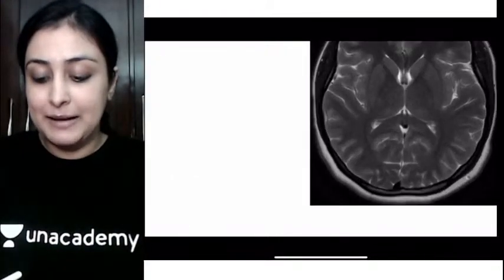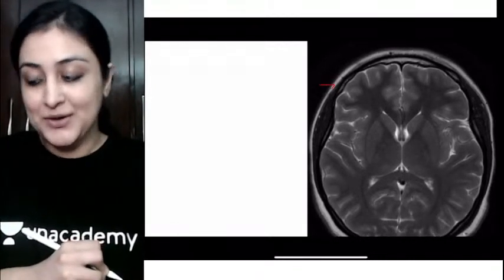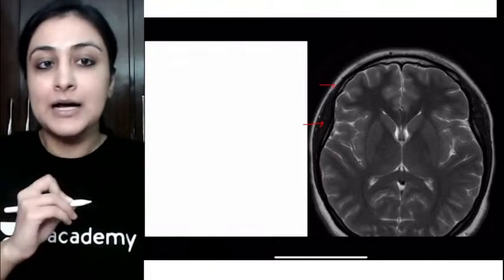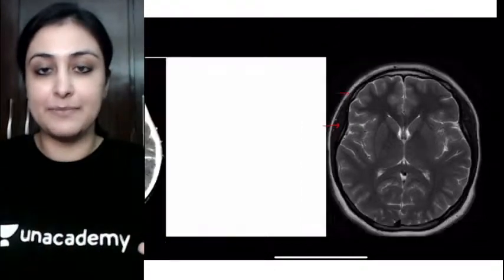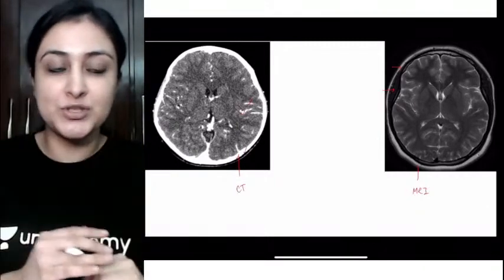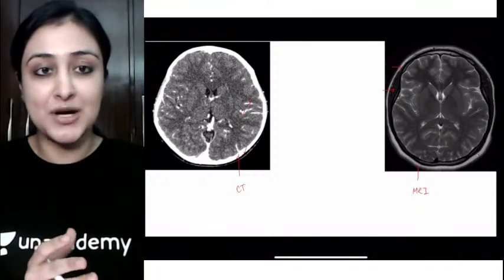On the other hand, on an MRI image, we'll see that this outermost layer that you're appreciating is the fat, the scalp layer. The annotated PDF is what you'll get. So scalp fat is what is hyperintense, and then within it, can you see this black thing? That black thing is the bone, right? So it's the bone cortex, and then you have the marrow. So this is the first step of distinguishing CT versus MR. Everybody feels confident that we'll be able to get through this first step of saying whether it's a CT or it's MR? Yeah, because this was also asked, right?